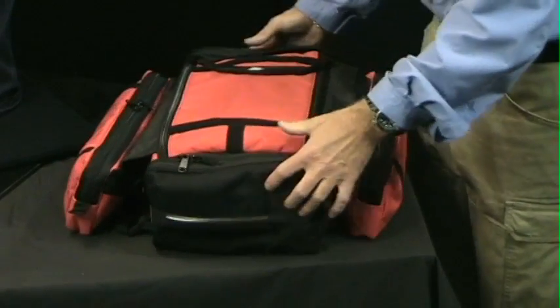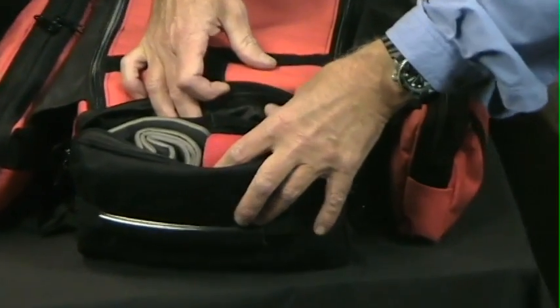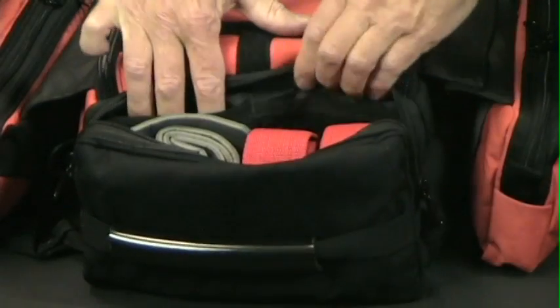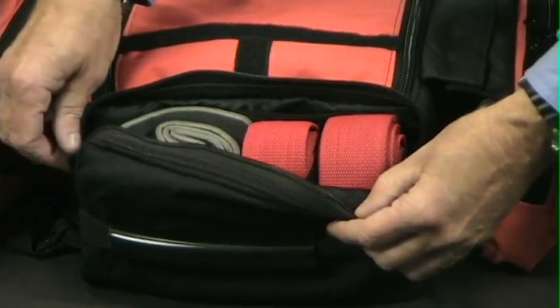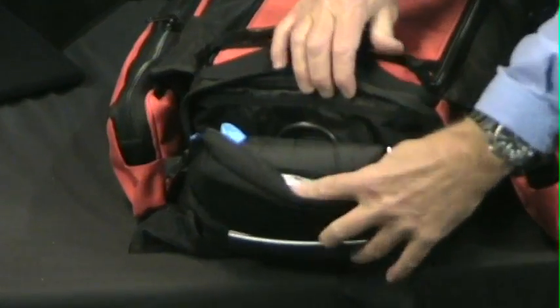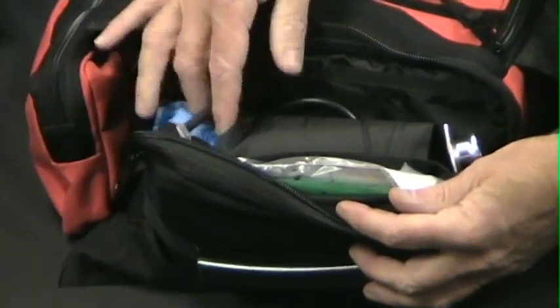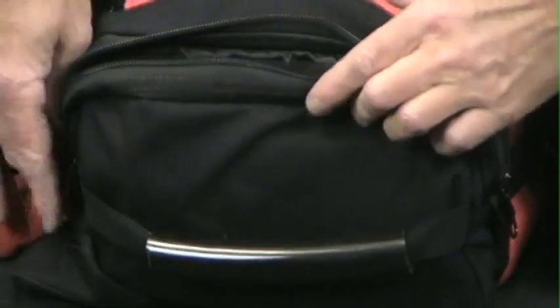The end pockets are fairly small, but they do have some capability of carrying a lot of different items because they are divided inside. This one right now is set up with some immobilization gear on this side. And on this side, this one is set up for assessment. So you've got gloves, blood pressure cuff, stethoscope, report booklet, etc.